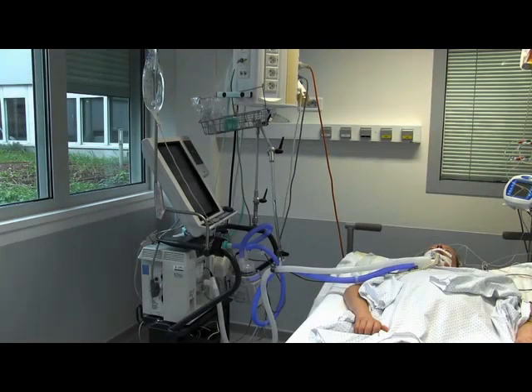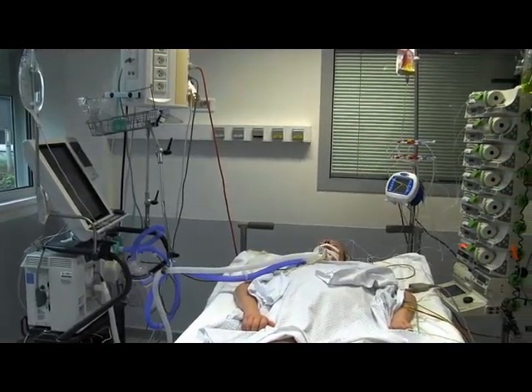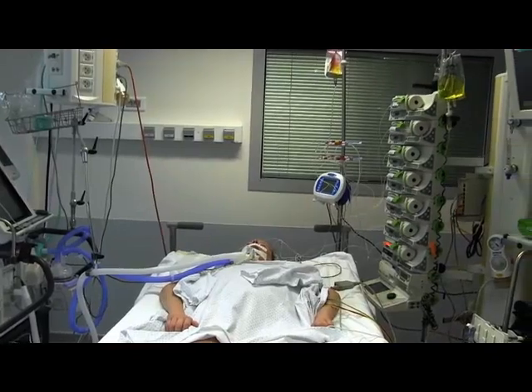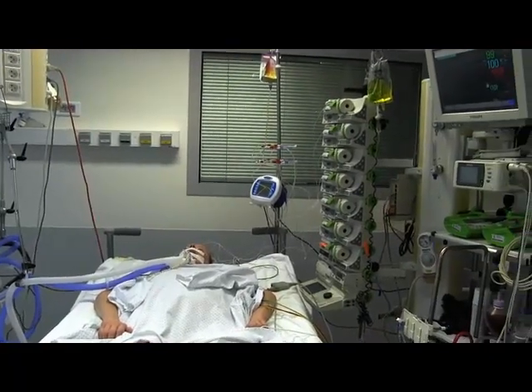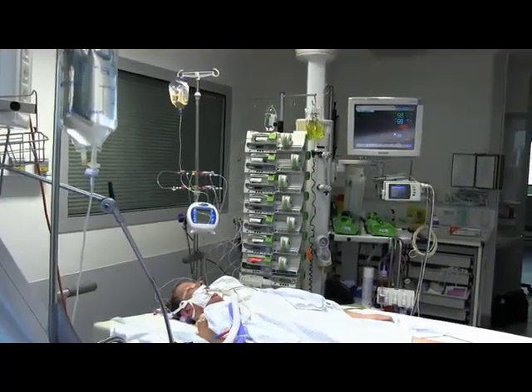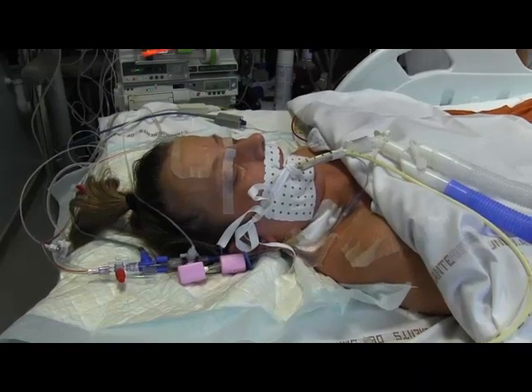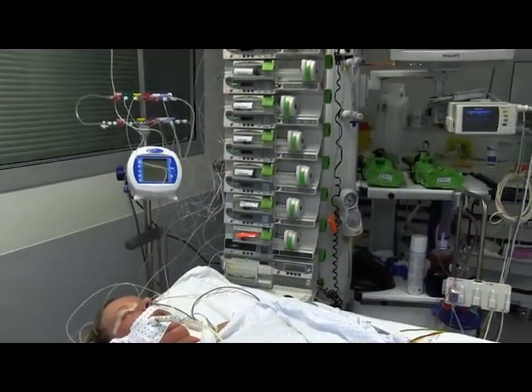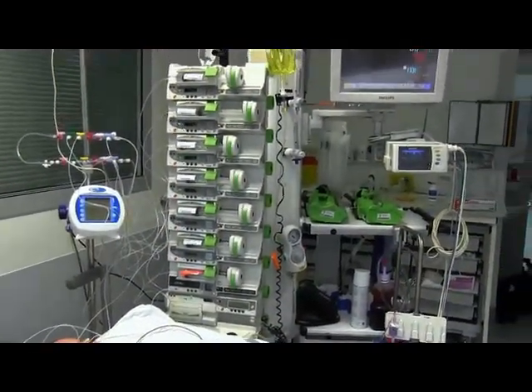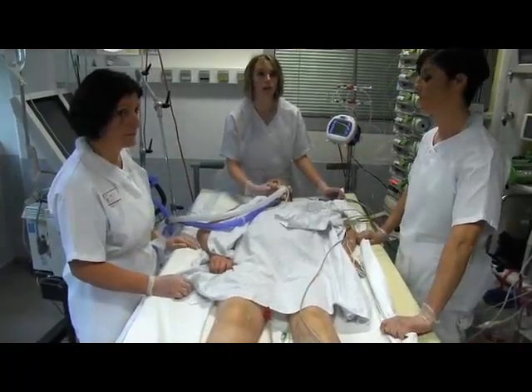Proning an RDS patient receiving invasive mechanical ventilation in the ICU must be done carefully to ensure safety during the procedure. For the procedure to be successful, it is vital to use trained and experienced staff. The procedure usually requires three to four people. One person remains at the head of the bed to secure the endotracheal tube and the ventilator lines, and this person coordinates the procedure. The other people position themselves on each side of the bed.